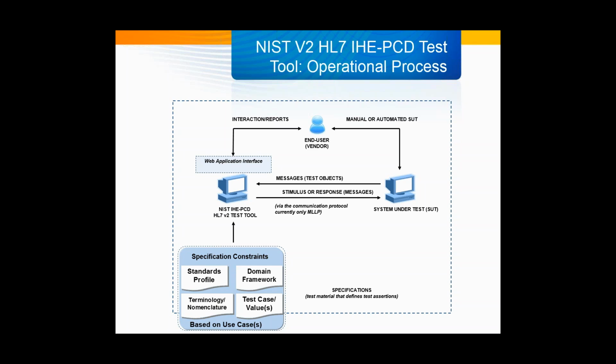So hopefully that gives you a sense of the two types of environments you can work under, and essentially they validate the same information, but one is more interactive and one is just kind of a static slice in time of a message that was sent and is now captured.